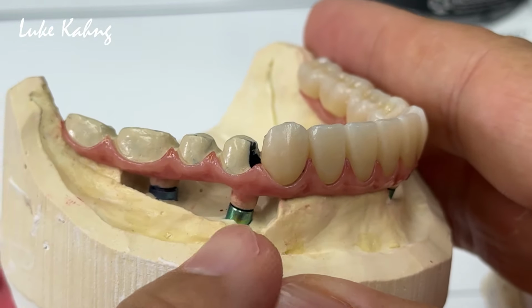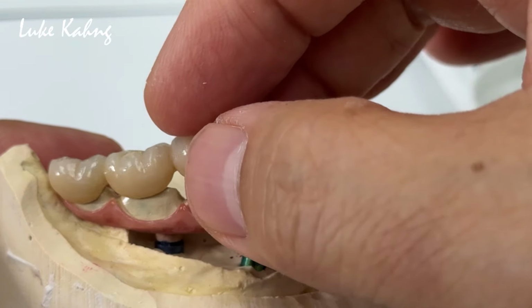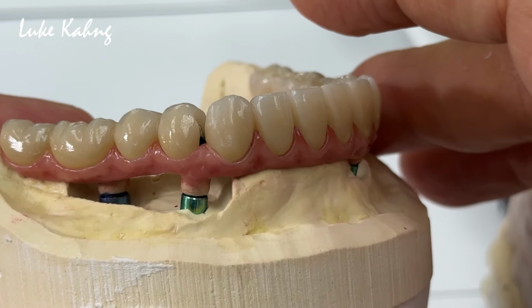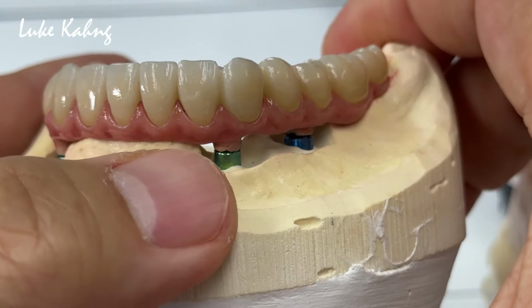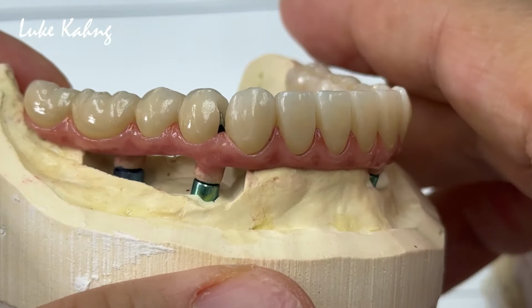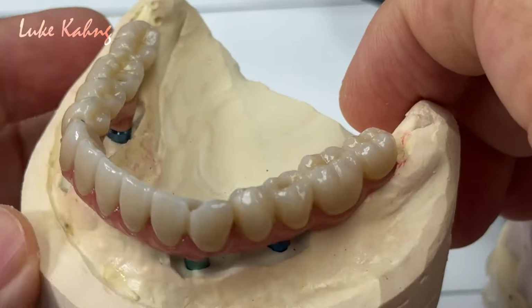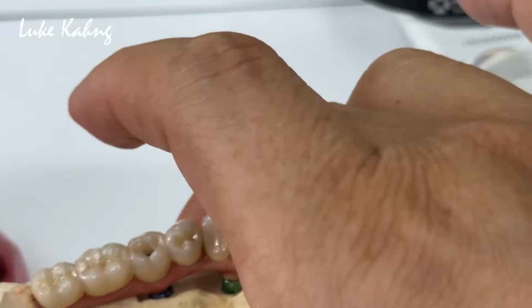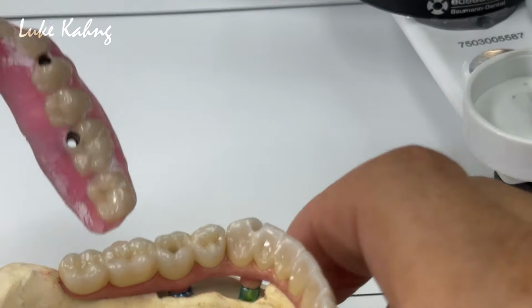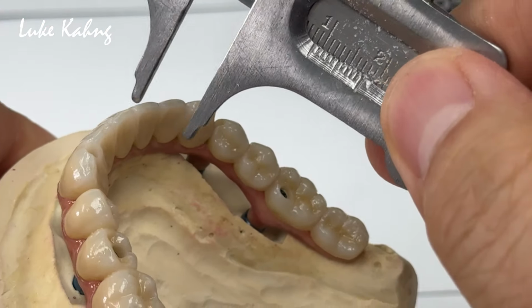And here is the only issue. The doctor has to put just a little bit of composite right after the screw down like that. That I cannot avoid. I wish I could skip that one, but I don't like the three implants for that. Anyway, this one is the final before we cement. That's why we're trying to make the restorations as thin as possible.